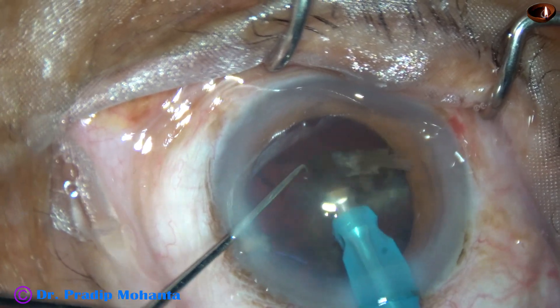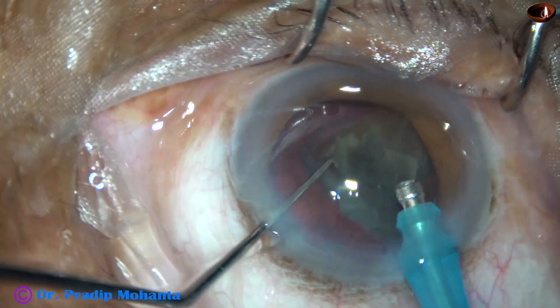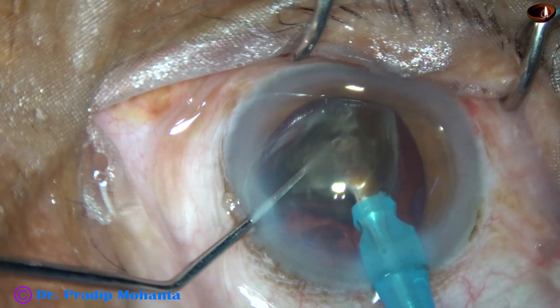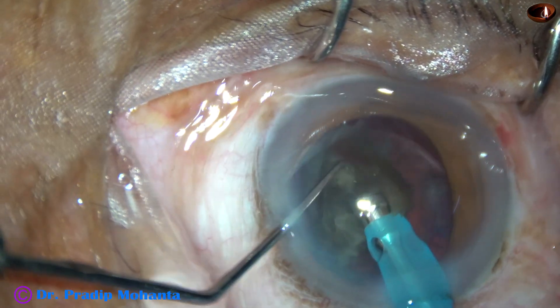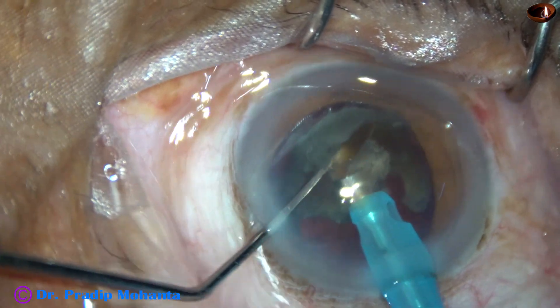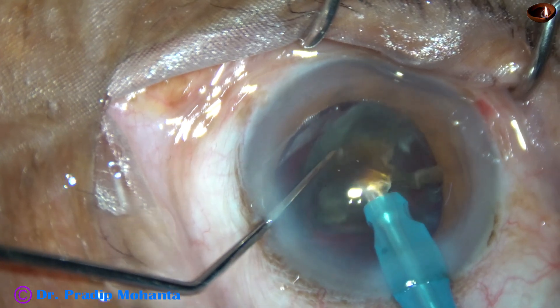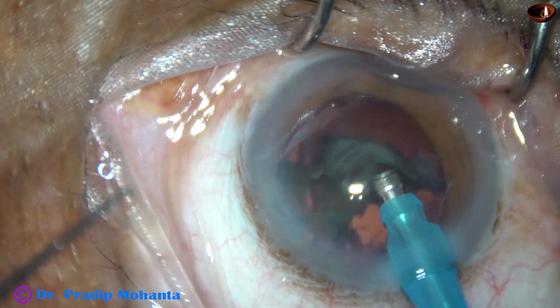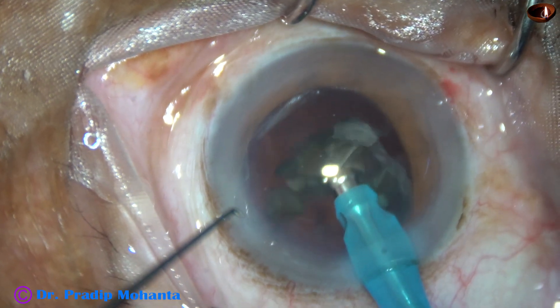Now watch the management of the last nuclear piece. It is rotated, emulsification is started from its apex — go through it, divide it into two smaller pieces. Emulsify the piece which is above, and a small piece remains below supporting the posterior capsule.